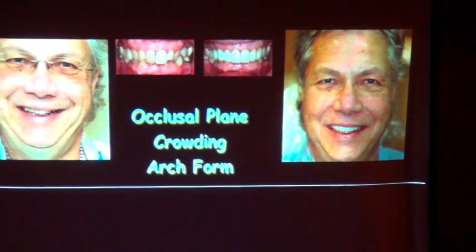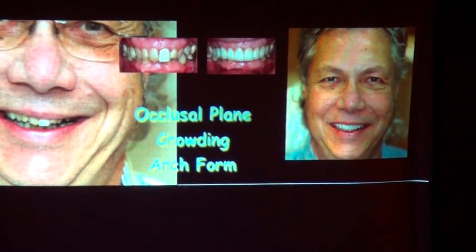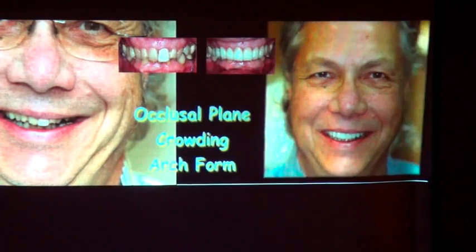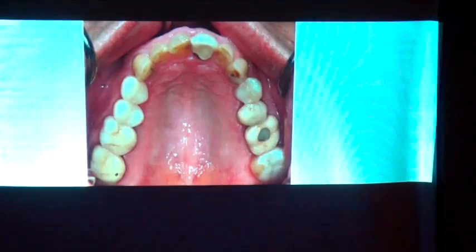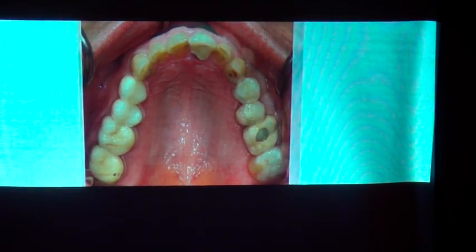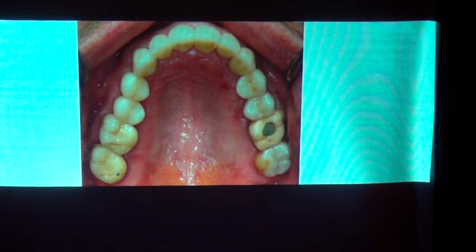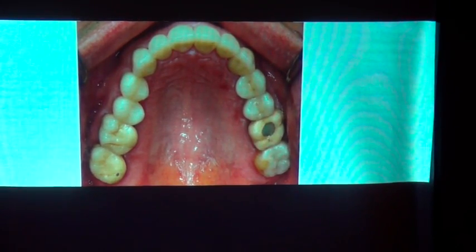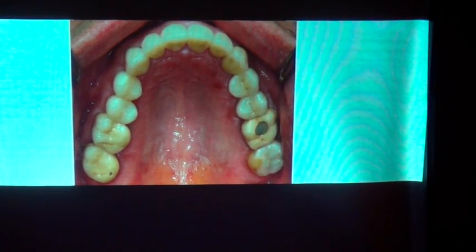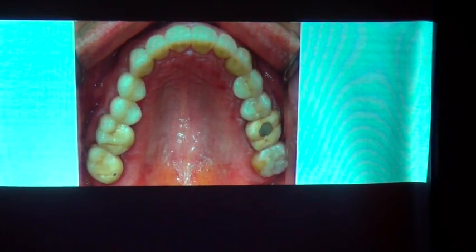So this isn't to say that intraoral photographs aren't important. Someone that has an arch form like this, we want to decide what the arch form is going to be. And the arch form needs to be developed by having a view of the palatal view. The palatal view you're going to give the patient is significant and needs to be communicated. Again, this view is important. Now, maybe some of the other views, those 62 views that Christian Coachman I showed you, you wouldn't necessarily take all those views if you didn't need them in a particular case.